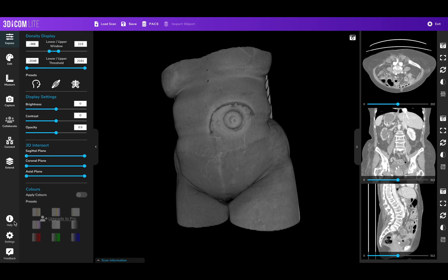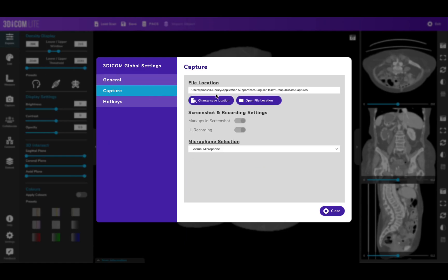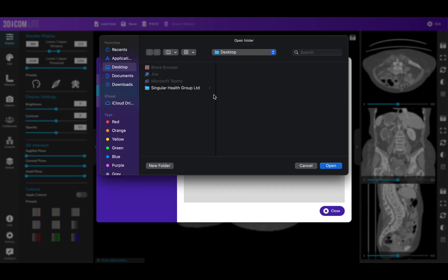However, if we want to change where we're saving the image, we can click on Settings, then Capture, and change the save location. We can then choose anywhere on this computer to save our files — we'll choose the Desktop.